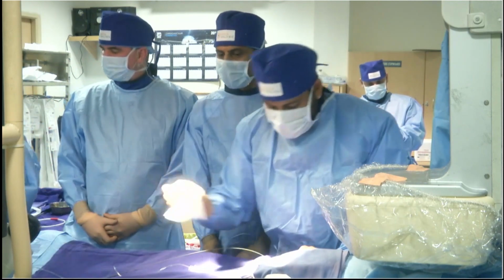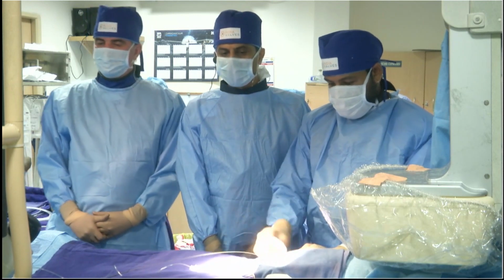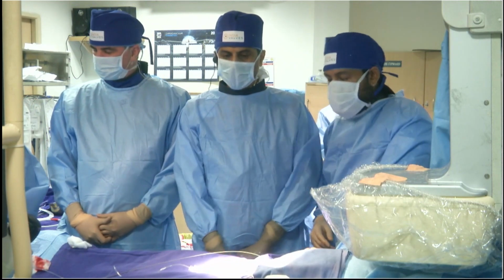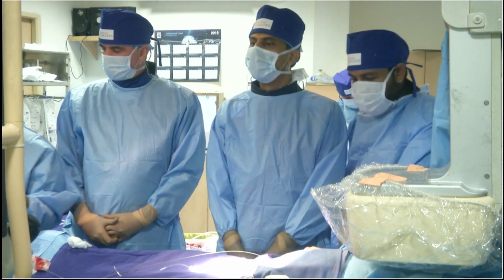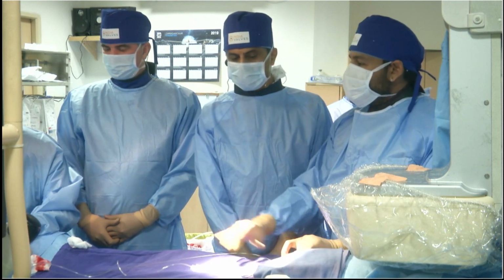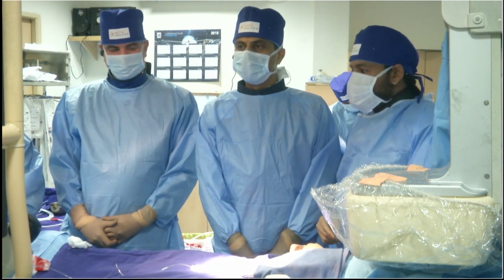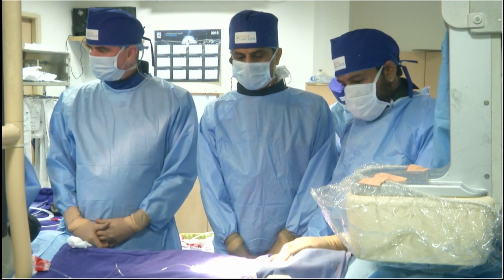The heparin is given now, and we are just going to do an angiogram with the pigtail and then take the big sheath and the Python sheath. Okay. So you have the right side. What about the left side? We already have an arterial and a venous line. The venous line has a balloon tip pacemaker, which we have already done, and we're just going to take the pigtail through the left side.